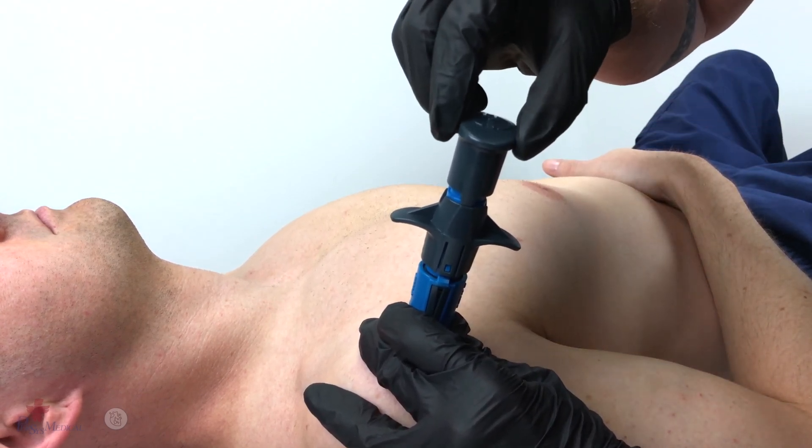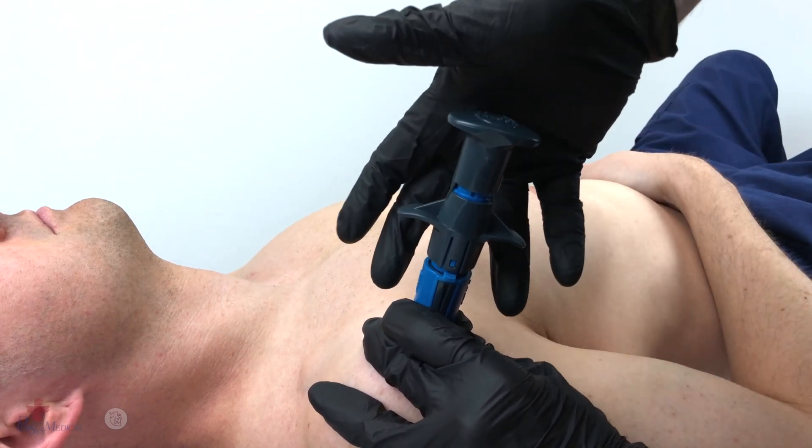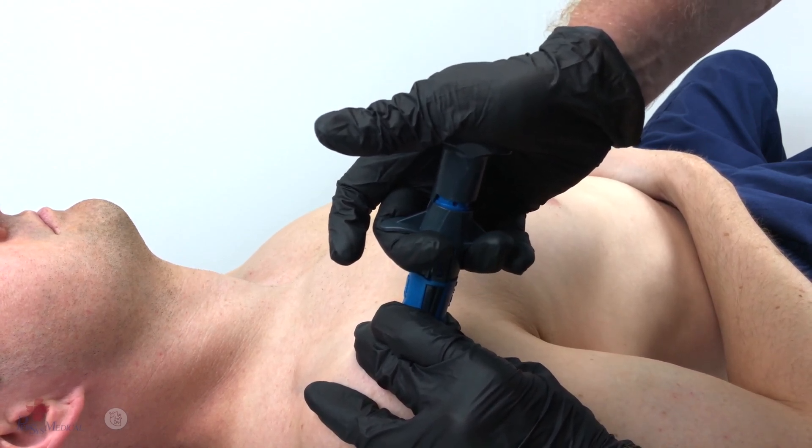Now rotate the safety cap 90 degrees. Utilizing the palm of that hand, fully compress the Neo, then pull up on the trigger wings, deploying the Neo.